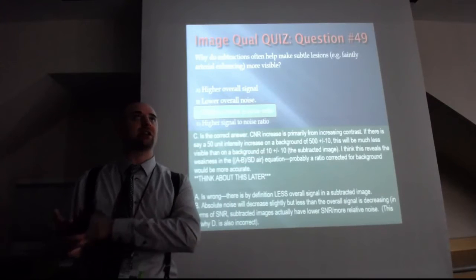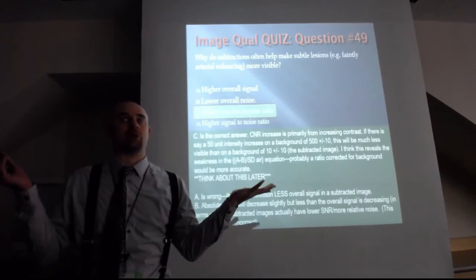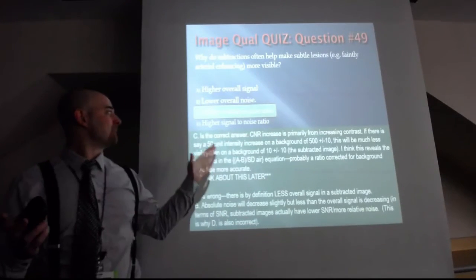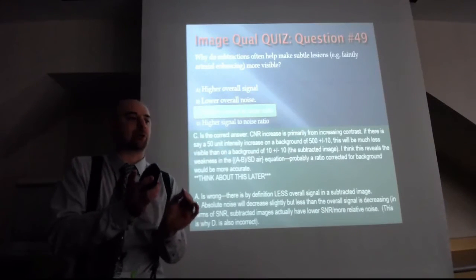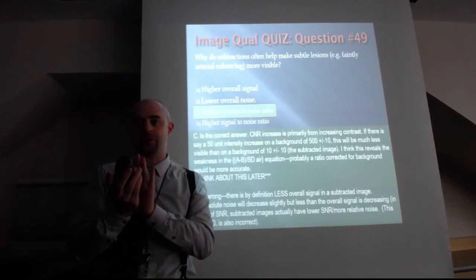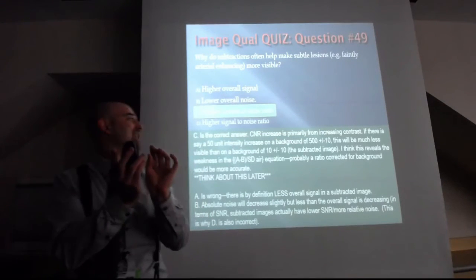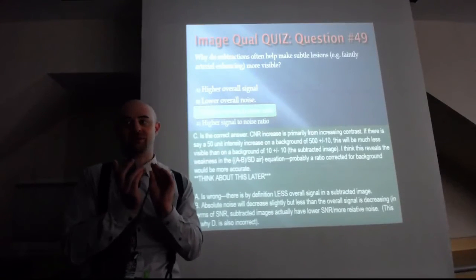Especially if you had an arterial enhancing lesion in the wall of the aorta, I'm just making that up, that doesn't really make sense. But when you gave contrast, it would make both brighter. It would increase the signal to noise in both similarly with one another. And as a result, the contrast would not be changed. Thus, you wouldn't be able to see it better.